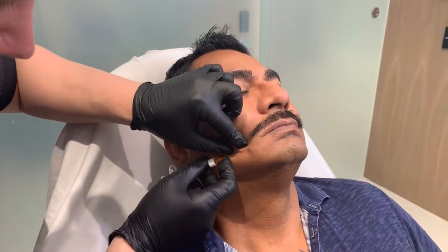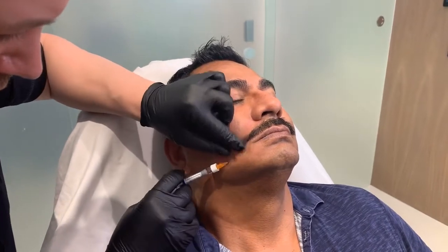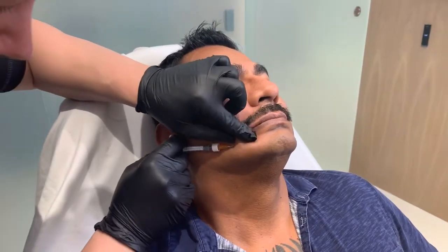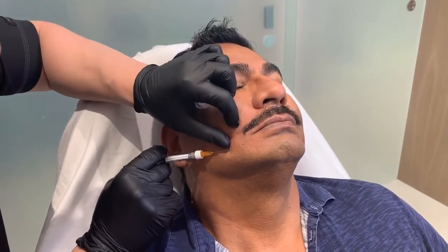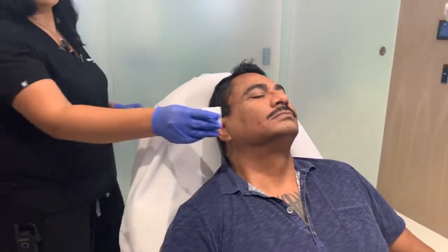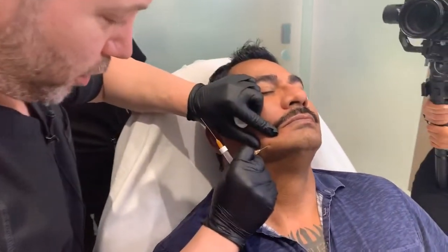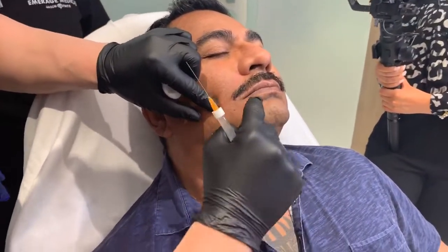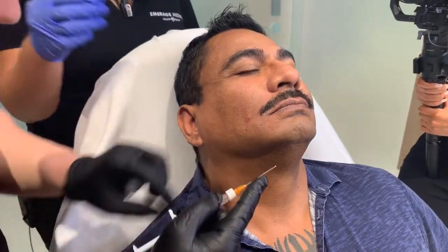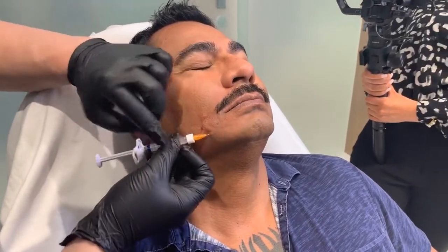Okay, we're going to go right to the edge of the corner of the lip, bear with me here, and just give him a little support there. Okay, now that was right to the corner. Now I'm going to go a little bit lower into what we call the marionette area. That's this triangle here to give support to the chin, mouth, and fold, because that starts to recess as we age. It's a weird feeling. I always tell people it's not the best.